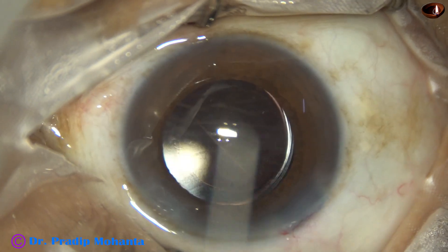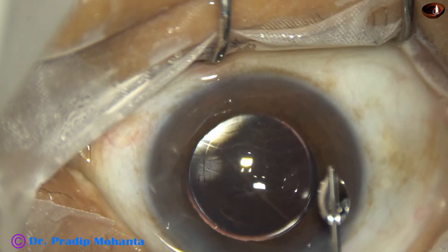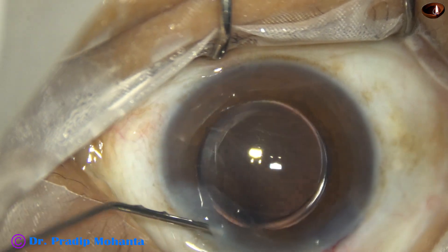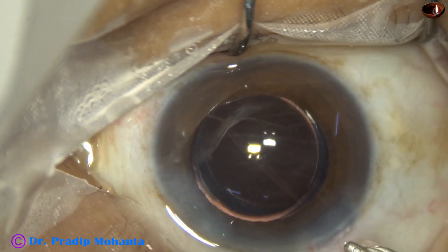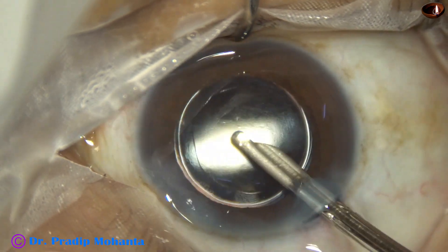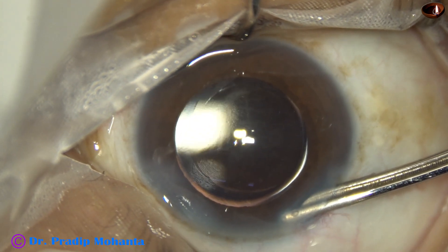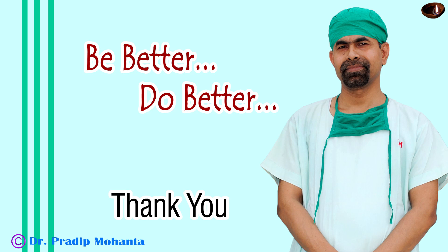This is a bit of adrenaline. The side port is closed by corneal stromal hydration. A final lavage of the anterior chamber is done with the help of a Simcoe cannula. The anterior chamber is nicely formed in this way and the case is concluded. Thank you very much for your attention. I hope this video will help you in developing your surgical skills — it will show the beginner surgeon how to do the pit and chop technique. Thank you very much.